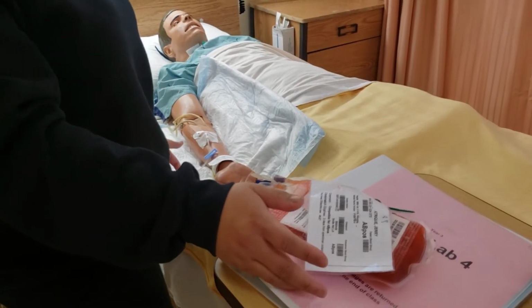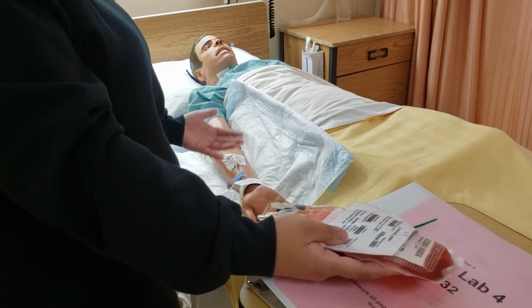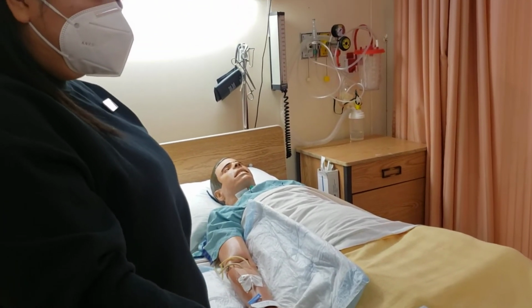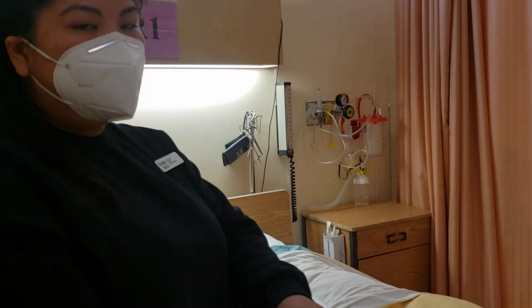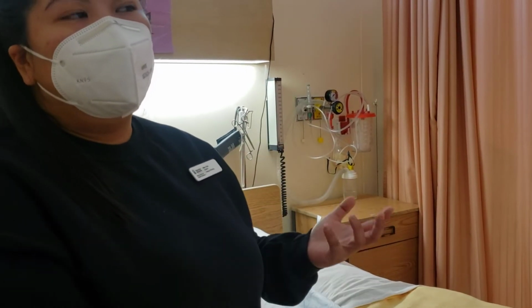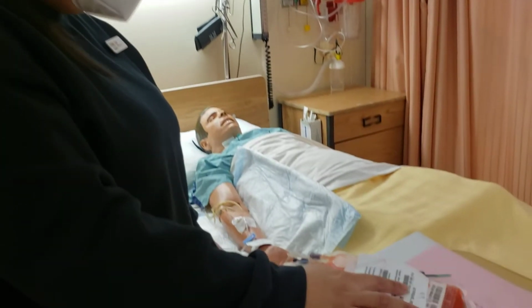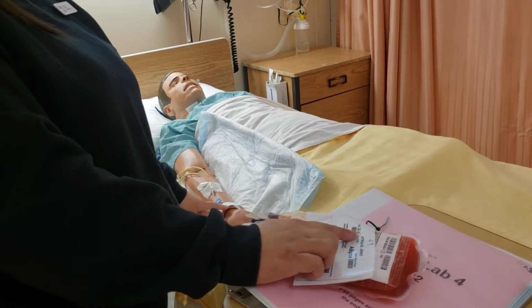I'm here to do a blood transfusion on you. I'll explain everything, but first I want to make sure that I have all the correct information. So my fourth check, I will check the blood tag, and my second nurse would check the patient's armband, and we also want to have the patient verbalize or spell out their first and last name if they are able to. So can you please spell out your last name and first name for me?